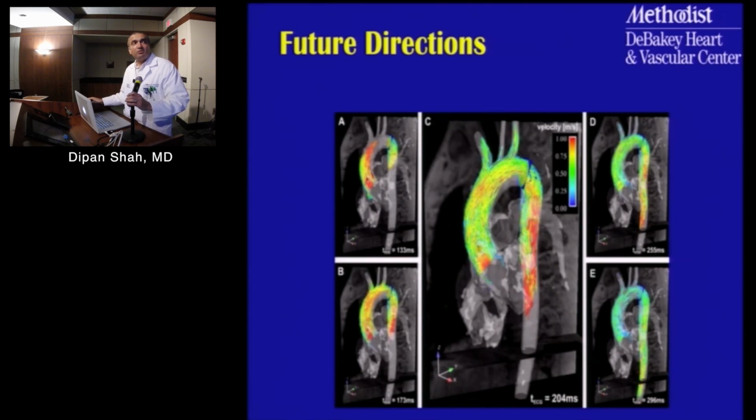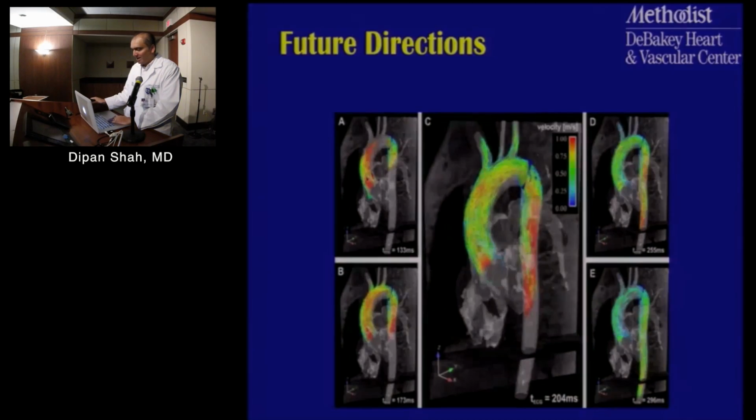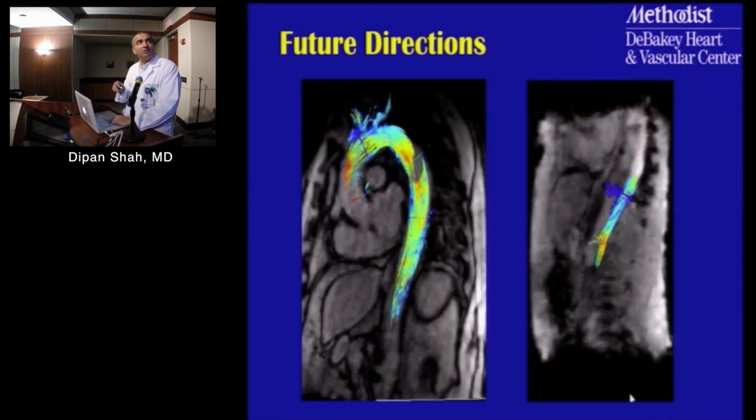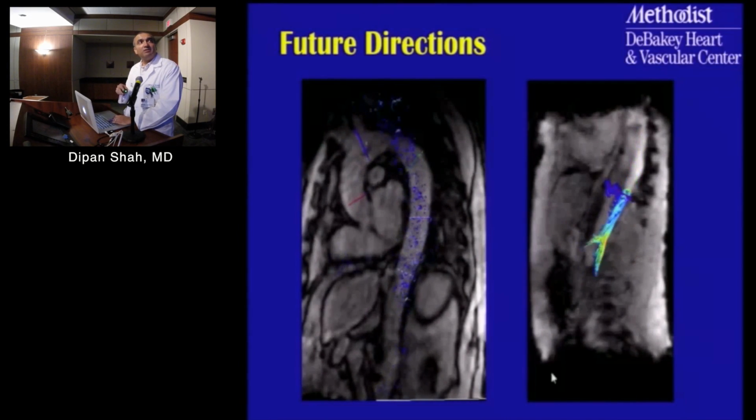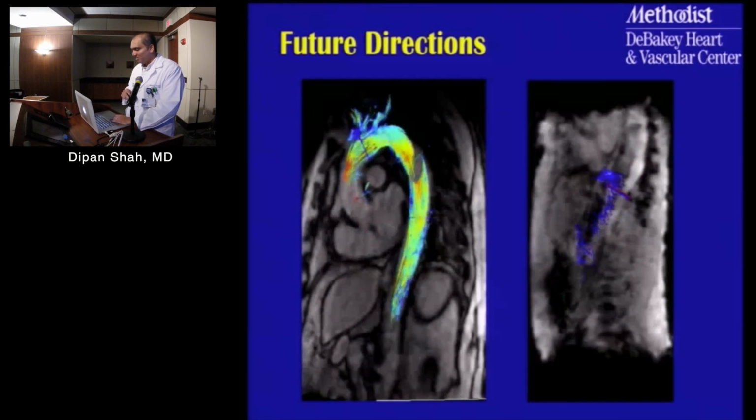There may be some advantages with that, because now you're not dependent on having been certain that you got the correct imaging plane at the time of acquisition. You can go offline after the fact on the 3D workstation and simply pick whatever imaging plane you want to interrogate with. Now, obviously, this is not something that I would say is ready for primetime clinical use yet, but I think it certainly offers promise in the future.